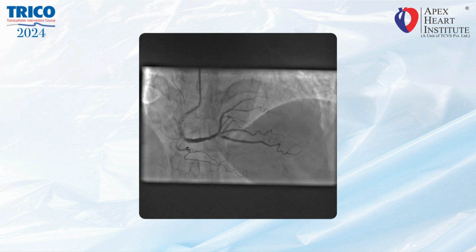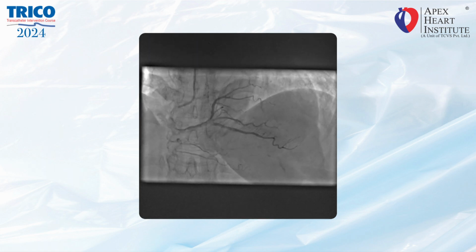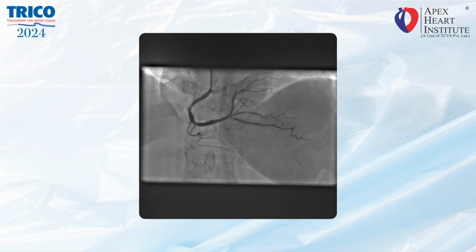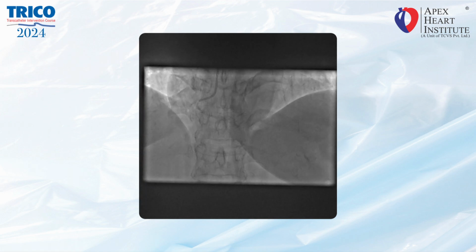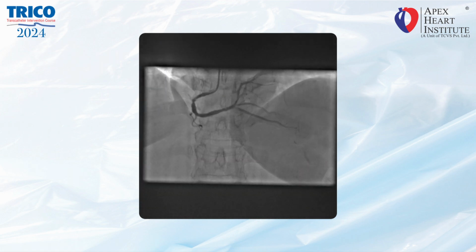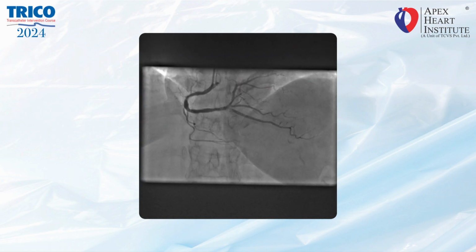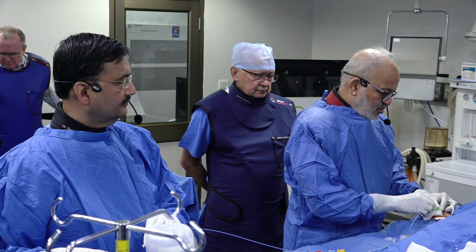So give me JR guide, and as usual, this is our default technique for any intervention. Combo technique, 5 French multi-purpose 125 centimeter and 6 French JR launcher. And again, this is the baby J wire from Terumo.